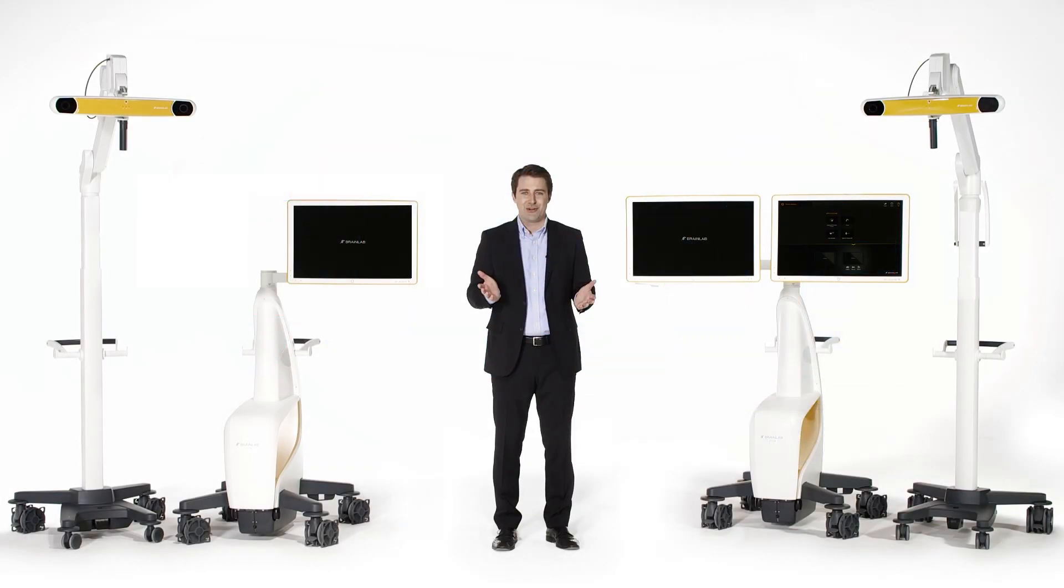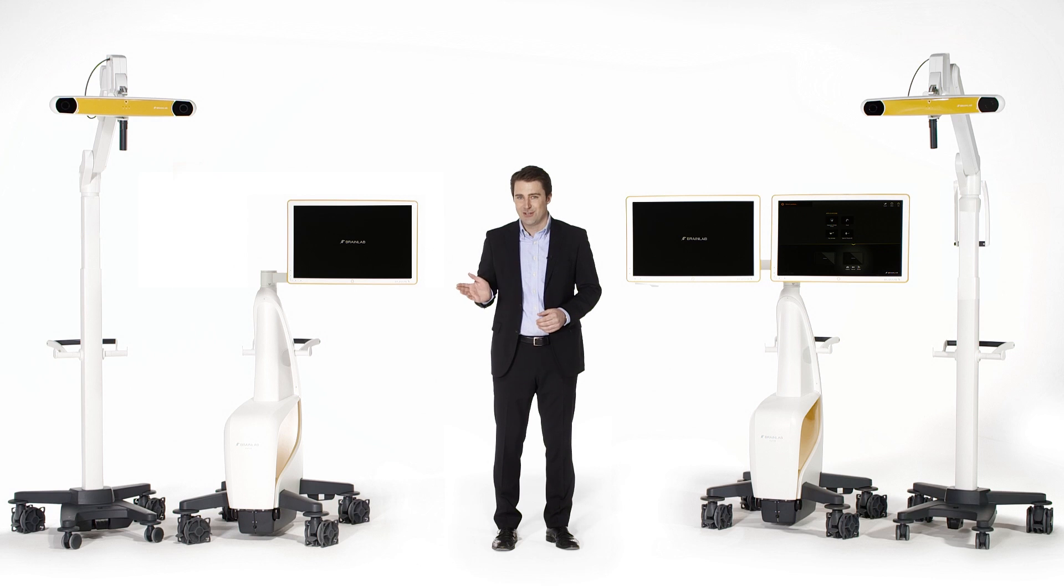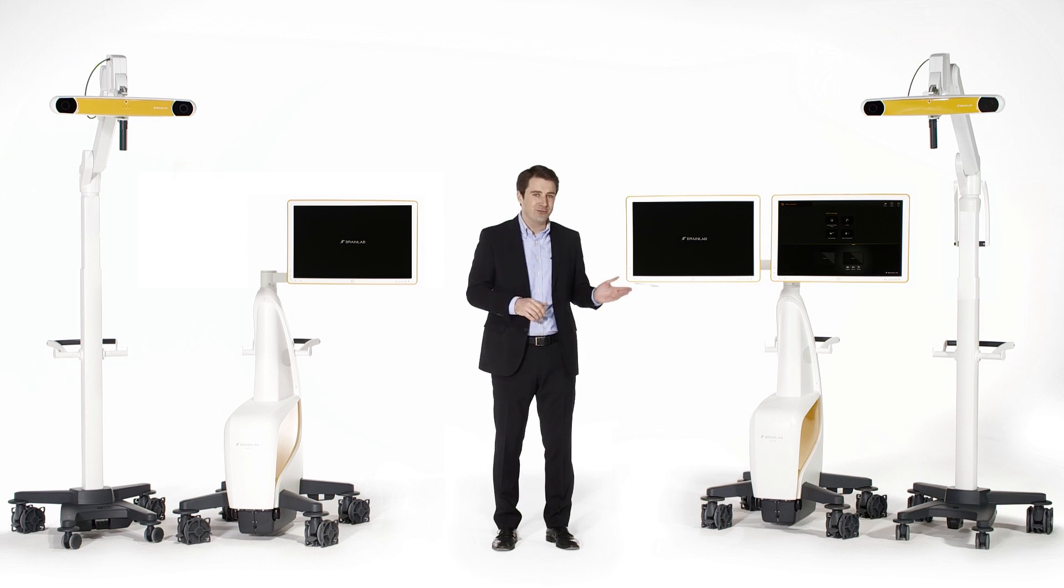This is Curve. Curve is our information-guided surgical navigation platform and is available as either single or dual display.